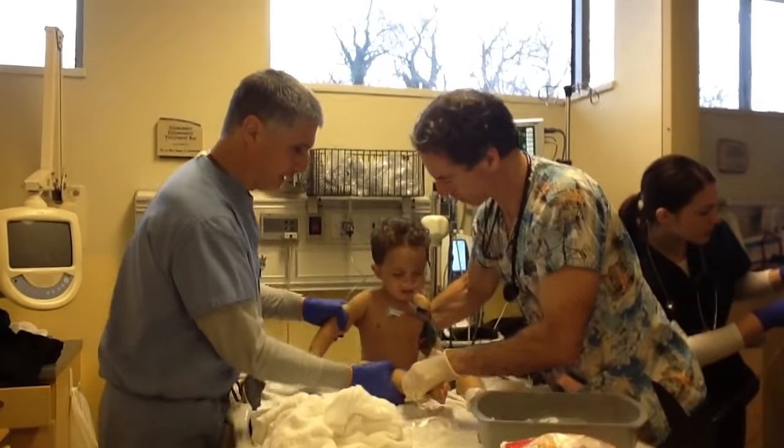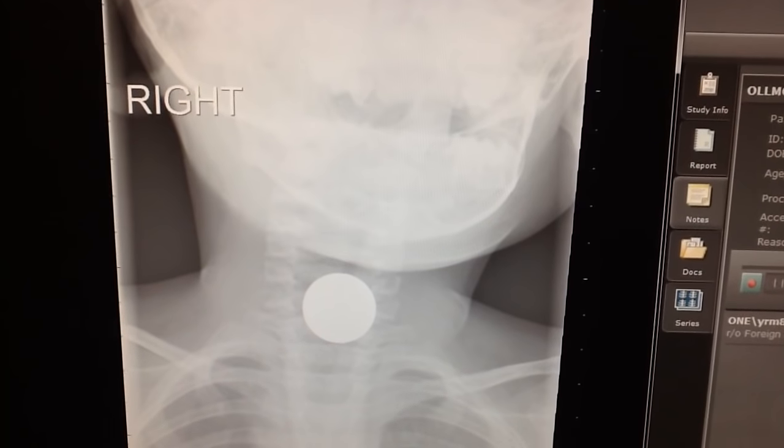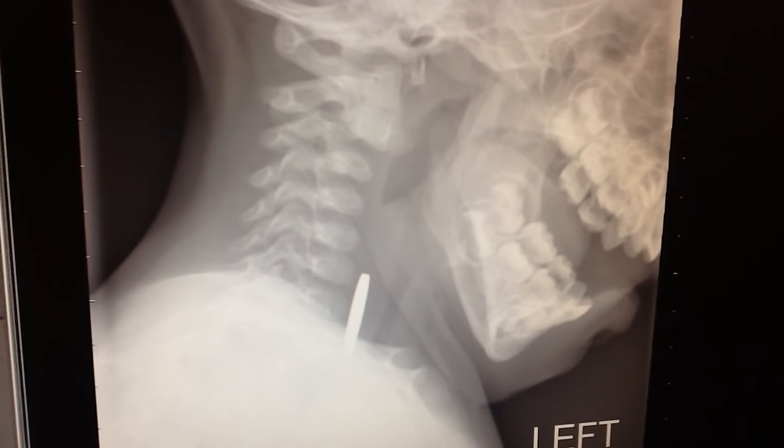This little guy ingested a coin and it's stuck in his esophagus. You can tell it's in the esophagus because it's transverse on the PA view, and on the lateral you see it on edge view.